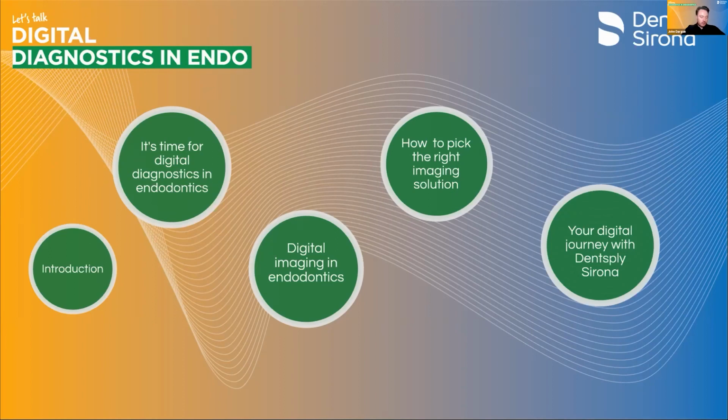Perfect. Thank you. There was a comment from Vanessa saying she always uses HD mode. There was a question about endo. I know a lot of people do use standard definition, but for endo, you really want the detail of it. You want it to impact your treatment. You want to know, is there an extra canal there? Where is that extra canal? What's the curvature? So I would never take an endo scan that wasn't an HD scan.